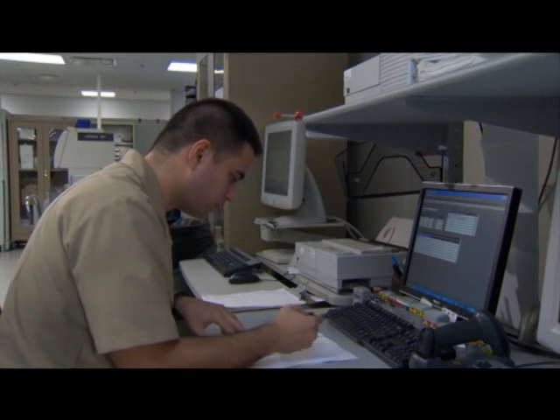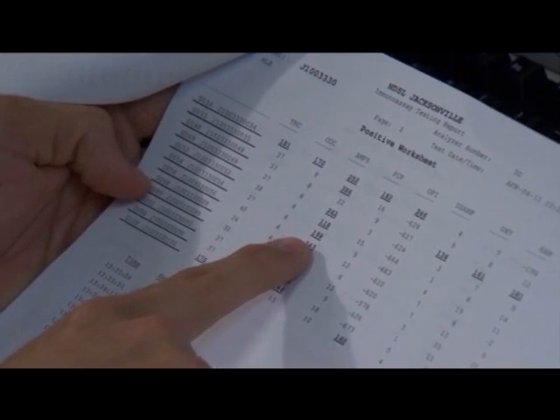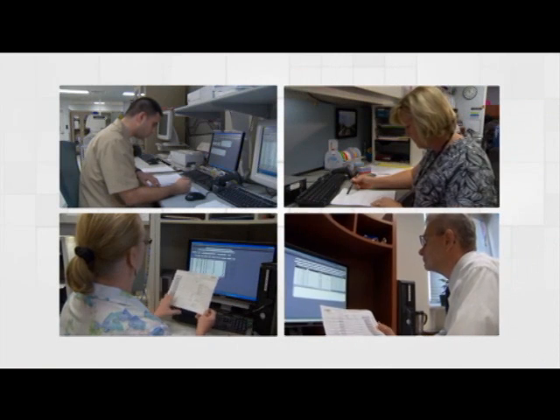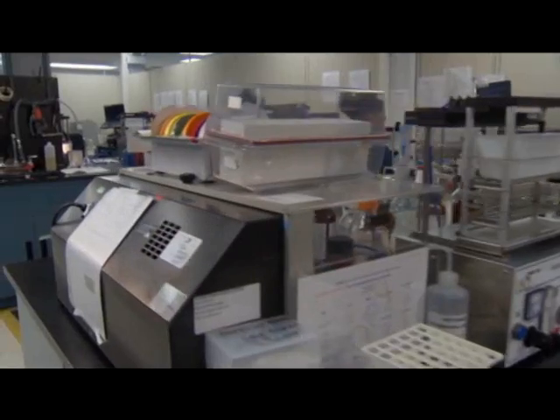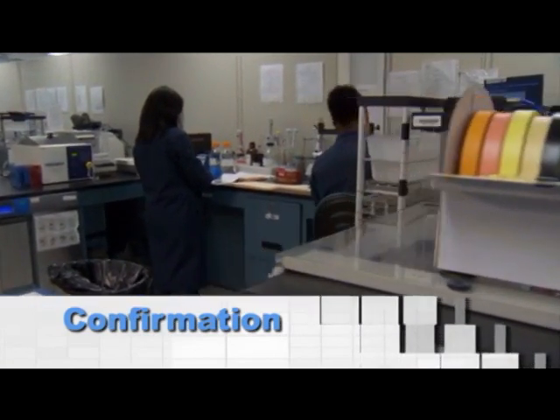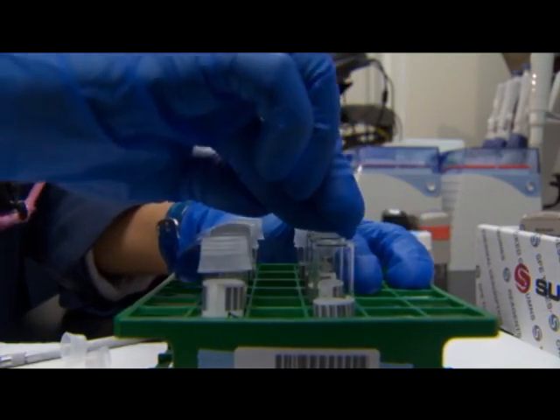If the drug is not detected in the rescreen, the specimen is reported negative and discarded. But if a drug is detected the second time, the results are once again verified through 4 levels of review. If the findings are certified, the presumptive positive specimen moves to a 3rd level of testing. This 3rd level is called confirmation. It is not a repeat of the immunoassay test, but a completely different and more accurate test.